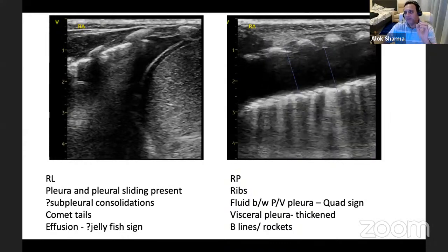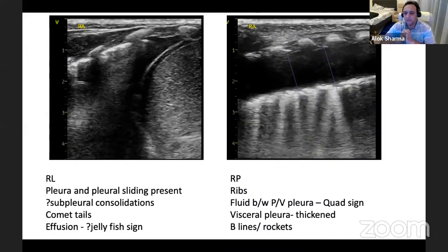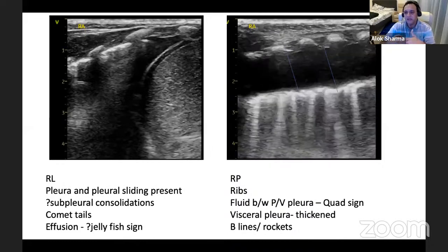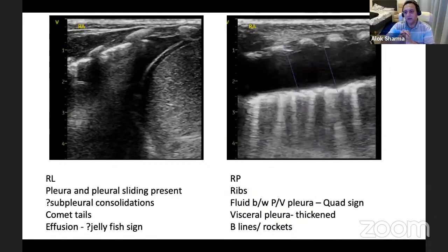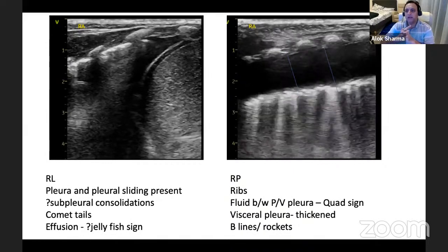And the benefit of that is a lot of us use butterflies to try and aspirate fluid. Now, I would say that there's a big risk in using a butterfly needle because, as the visceral pleura comes close to the parietal pleura if you're doing this as a blind procedure, eventually the needle punctures the lung. And often when you're trying to drain fluid, you end up creating what is called a hydropneumothorax.